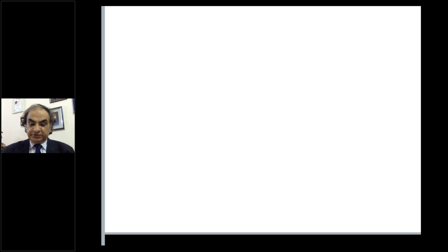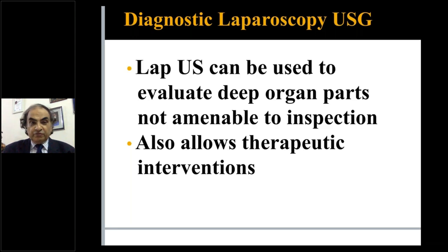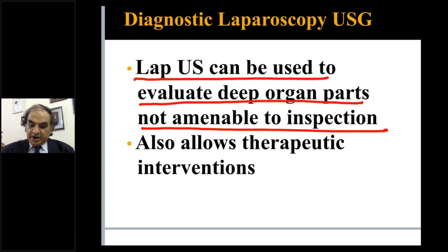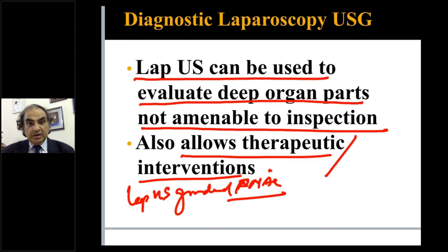Now that's diagnostic laparoscopy ultrasound, which I have just touched here so that we don't have to go far. It can be used to evaluate deep organ parts, not necessarily the superficial parts, but the deep part, whatever is not amenable to inspection. It also allows for therapeutic interventions like a lap ultrasound guided FNA. So you can use this for doing the needful, right? Now, the diagnosis is clear, and what you do is also clear.